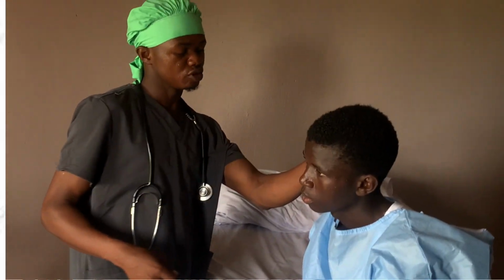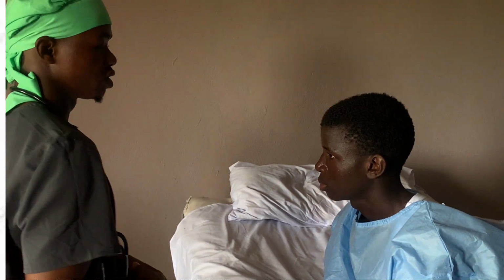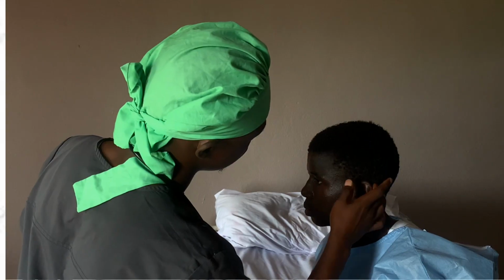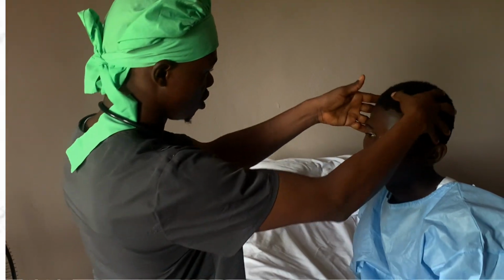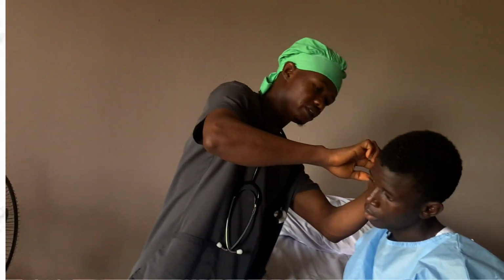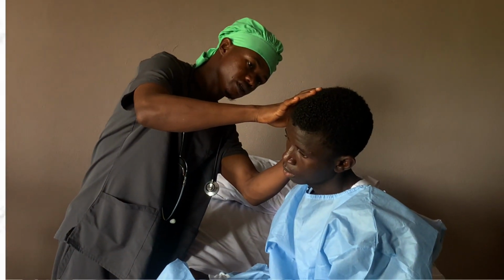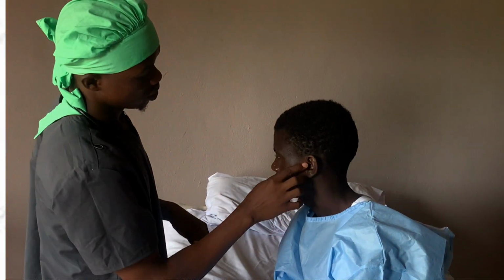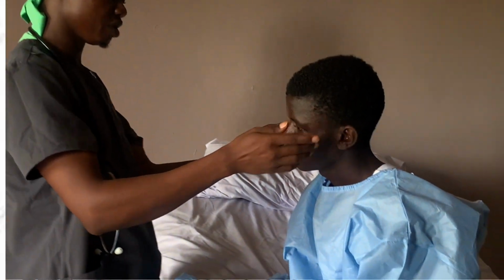I continue with the assessment of the ear. I assess the ear on both sides. I check for size, color, any swelling. Is there any tenderness? I palpate for tenderness or pain. Is this symmetrical to this? Yes, you can see that both ears are in the same position. Okay, that's very good. Then I inspect into the ear canal for any wax, any swelling, any drainage. I palpate around the tragus and the auricle. If you feel any pain, please report that.